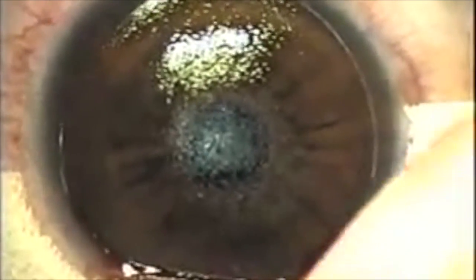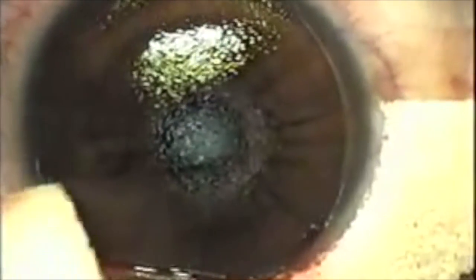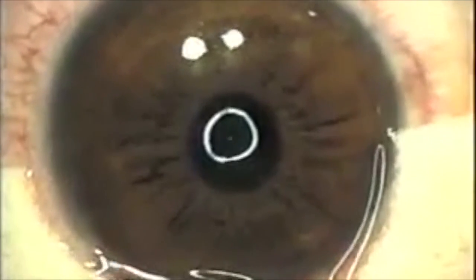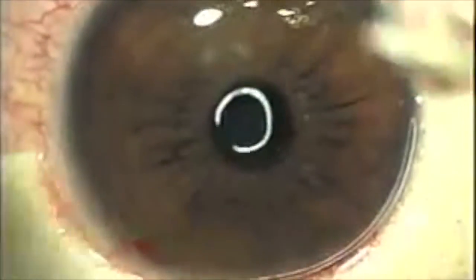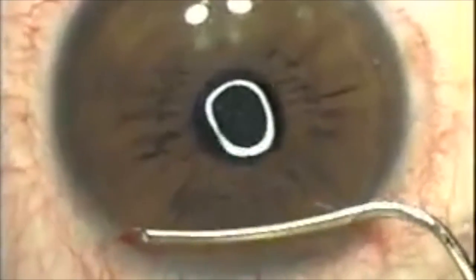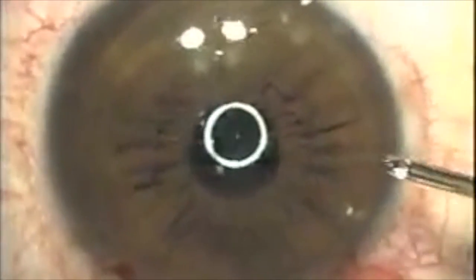So now the stroma is completely corrected by the laser, and the surgeon is just cleaning up around the flap so the corneal flap could be reapplied from the hinge. And those are more re-wetting drops to clean away any irregularities or abnormalities in the eye. And the corneal flap has just been placed onto the stroma, and now the surgeon is just doing more cleaning around the area that's been worked on.